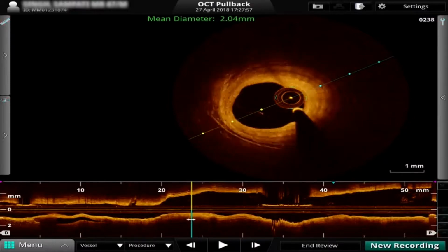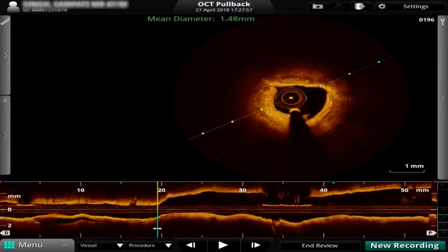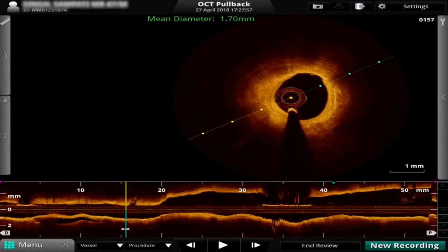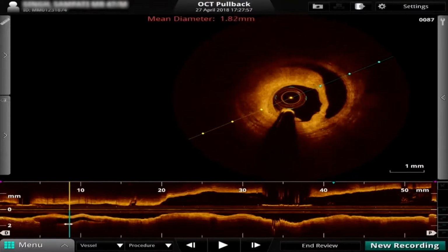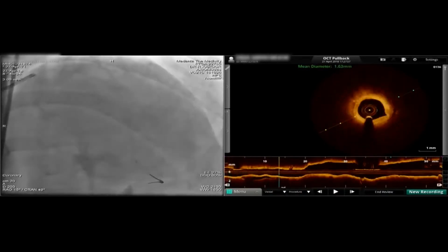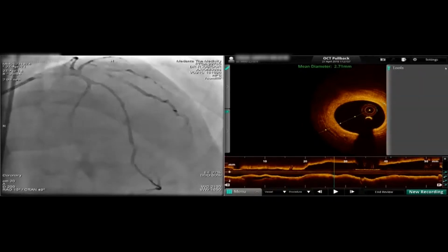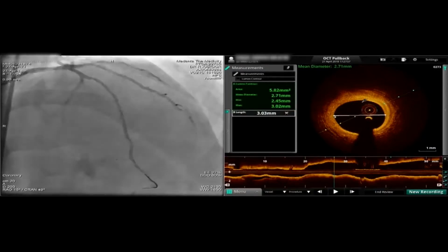Okay, so let's first have the small stent distal. Keep the FFR ready, we'll do the FFR after stenting the LAD. I personally think that if you have iFR, you can measure iFR with the wire and understand exactly, from the difference in the values, either your LAD stenosis or the left main. For me, it's also a quite good method to evaluate the length of the stent in the LAD. Otherwise, if you use adenosine, it's better to stent the LAD first and after that assess the left main.